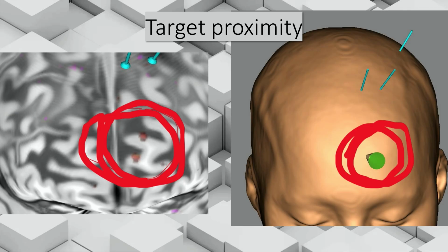How much do I believe that 0.67 on connectivity versus 0.72 is really meaningful, especially, as was pointed out earlier, there's some drift in time with resting connectivity? I would say those are above my threshold for saying that I have a good target, and having a backup target ready in case you need it could pay off for you.